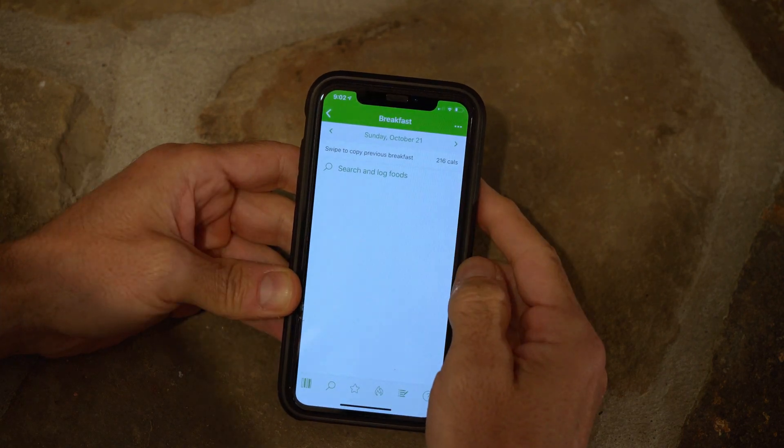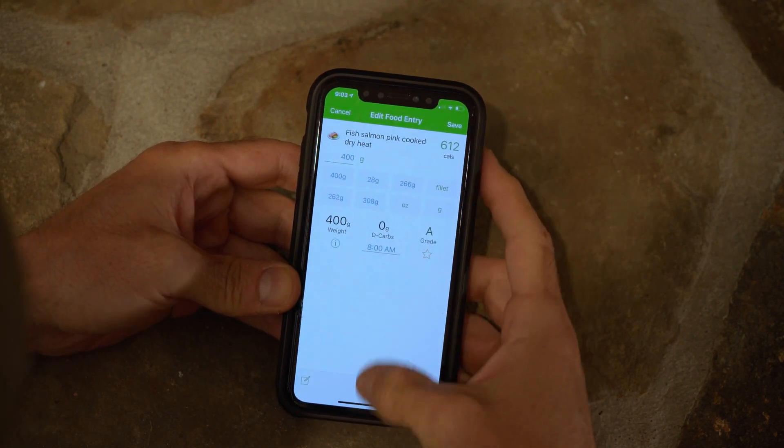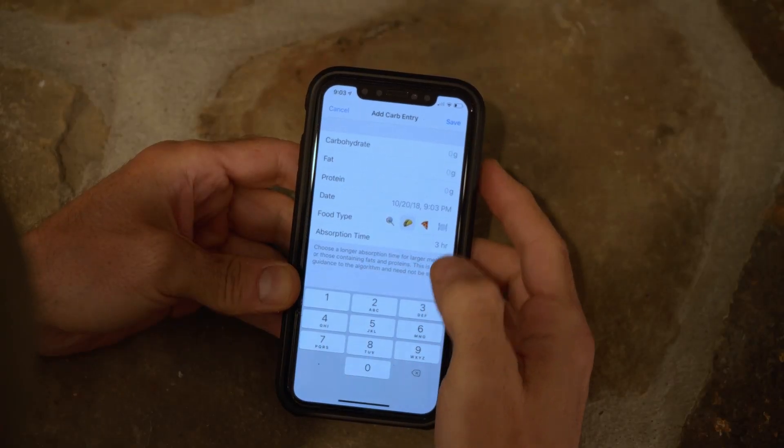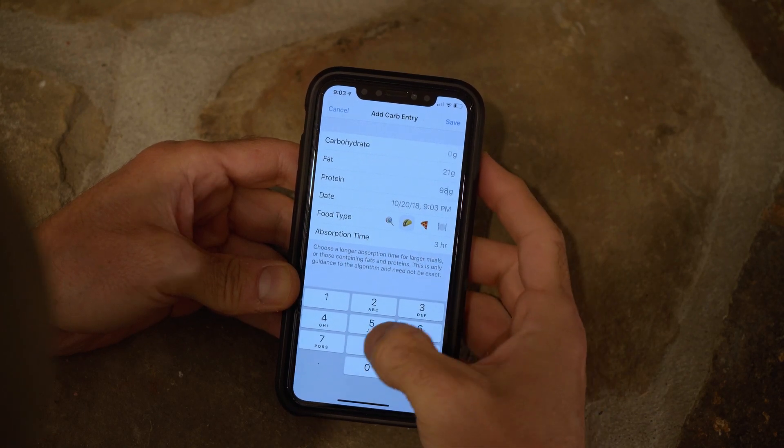Here is a no carb example — 400 grams of salmon. That is zero carb, 21 grams of fat, and 98 grams of protein. We can come into Loop and enter 21 fat and 98 protein.